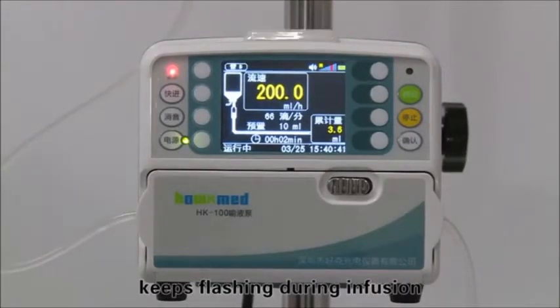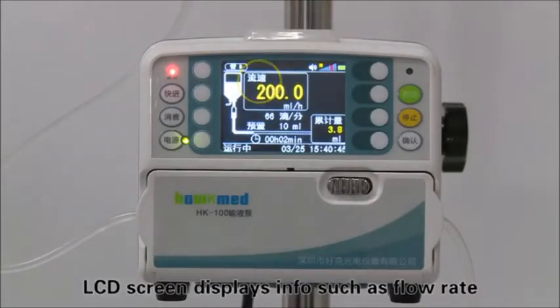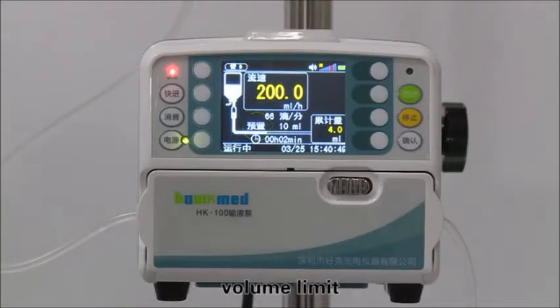The green indicator light keeps flashing during infusion. The LCD screen displays information such as flow rate, volume limit, accumulated volume, and remaining time.